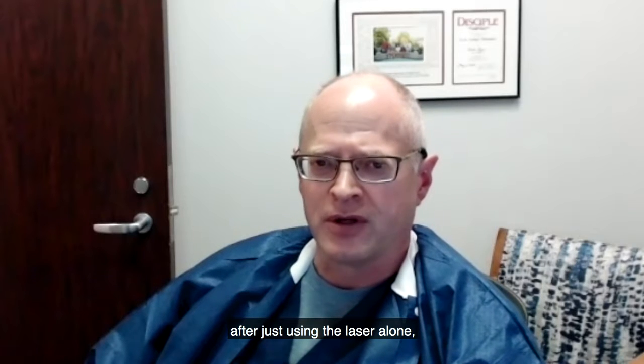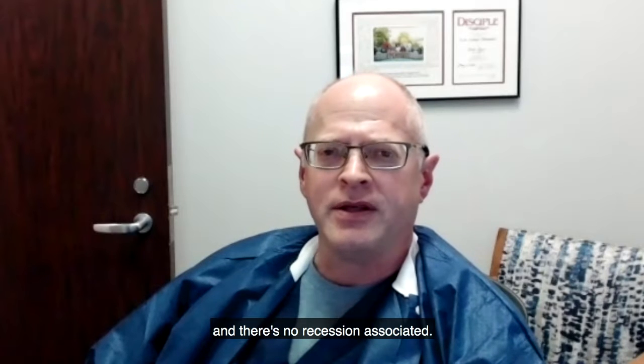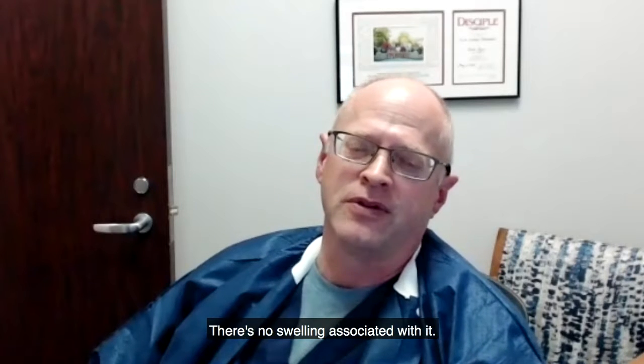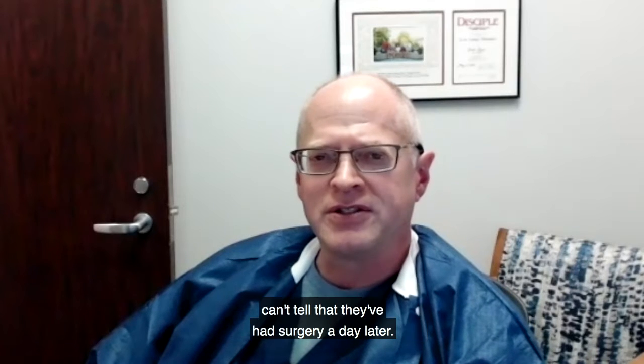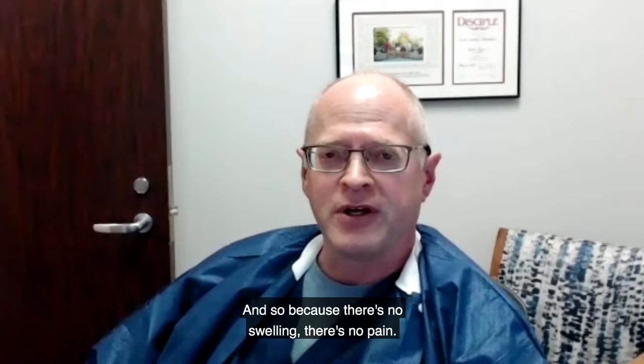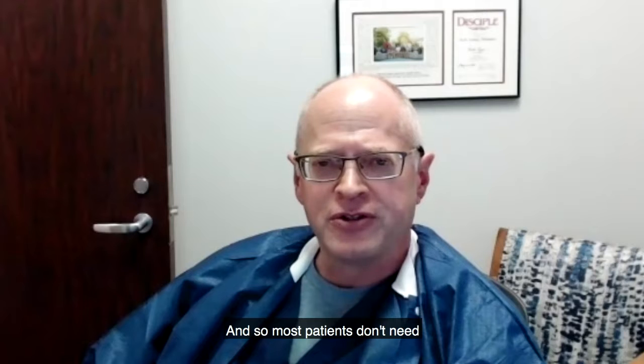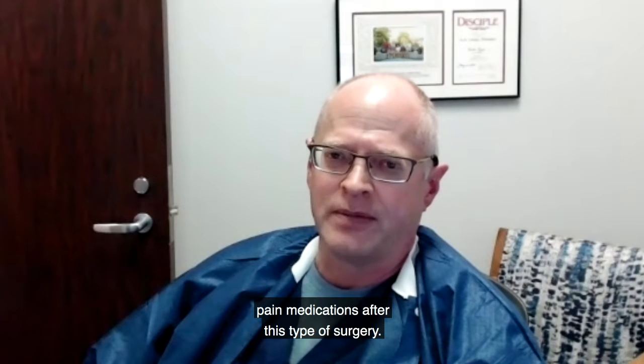The normal healing process after just using the laser alone is that the gums re-adhere to the surface of the teeth, and there's no recession associated with it. There's no swelling associated with it. Many times after surgery, patients can't tell if they've had surgery a day later. Because there's no swelling, there's no pain, and most patients don't need pain medication after this type of surgery.